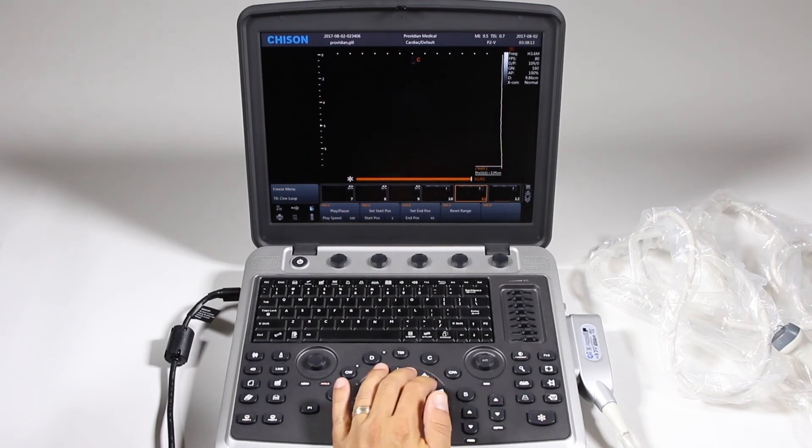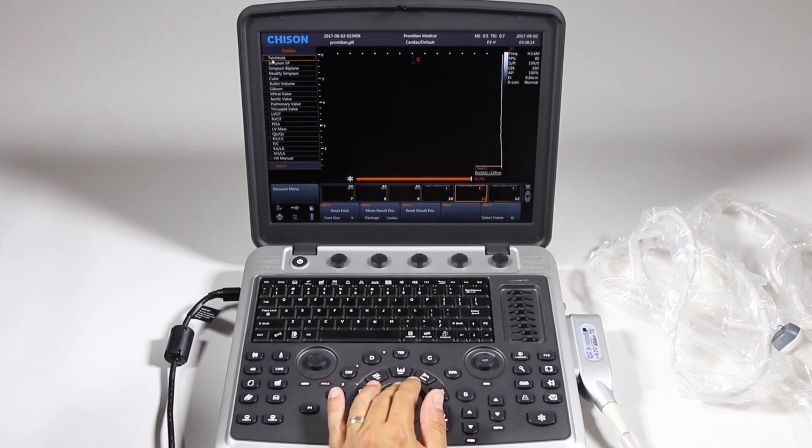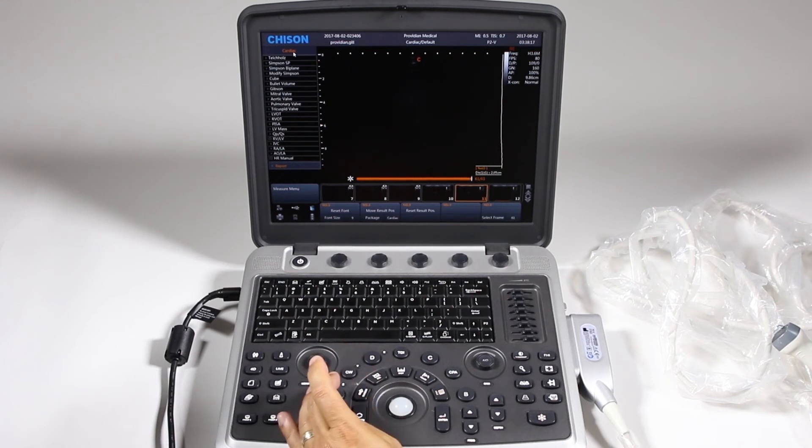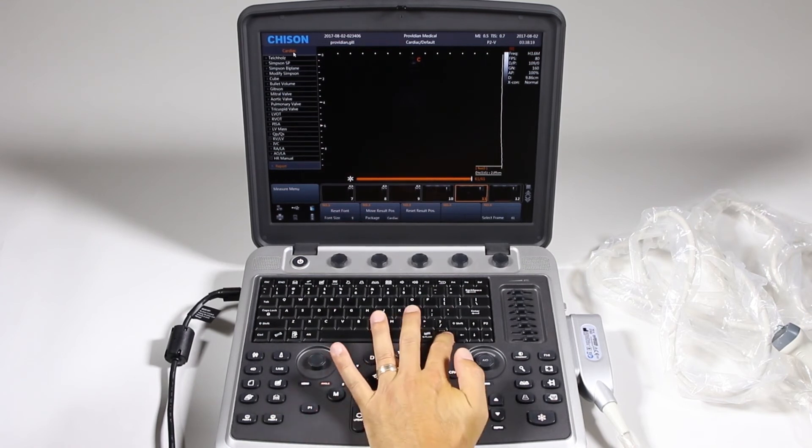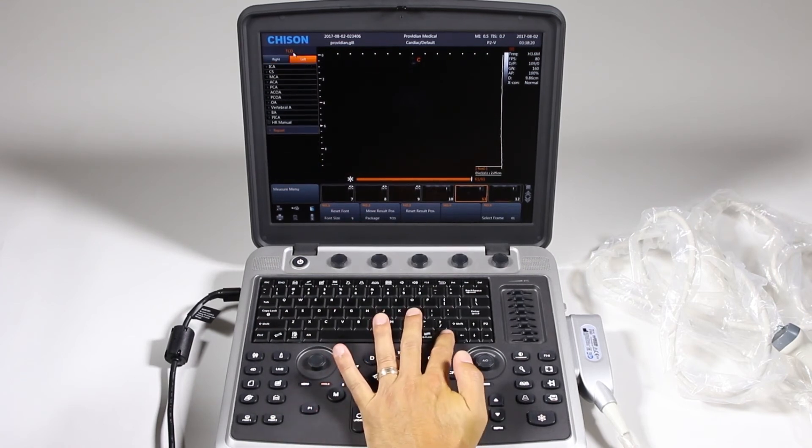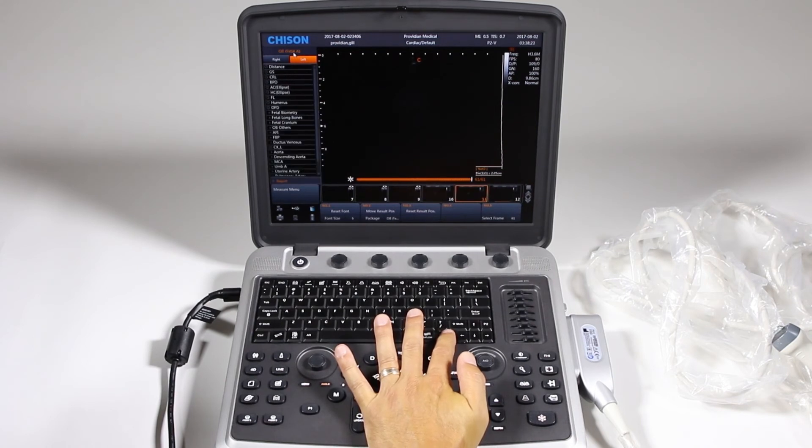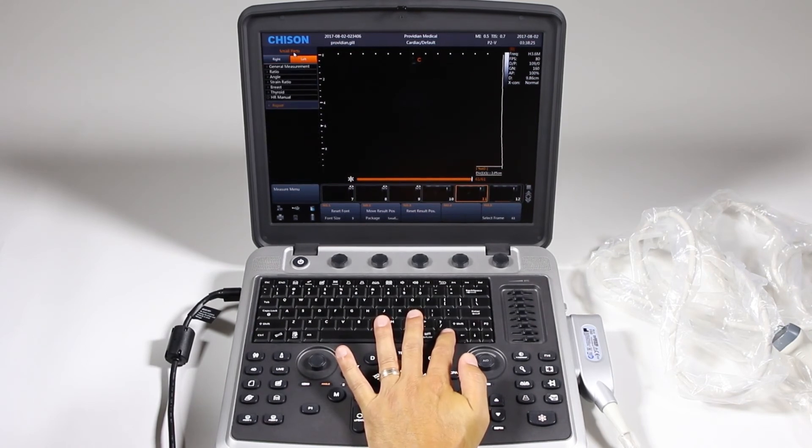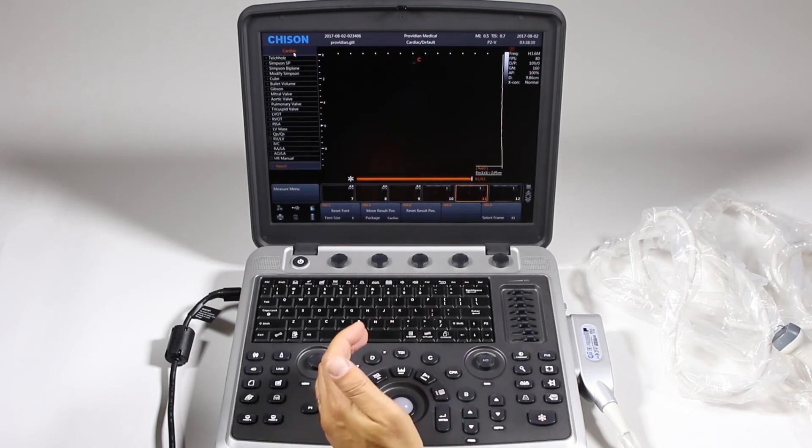For the reports, you want to go ahead and click calc and this says cardiac here. So say I don't want cardiac, I can hit this change button and it will flip through all the different calculations packages: OB, vessel, urology, small parts, pediatrics, carotid, and back to cardiac again.